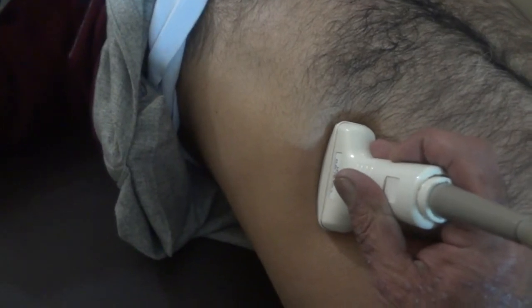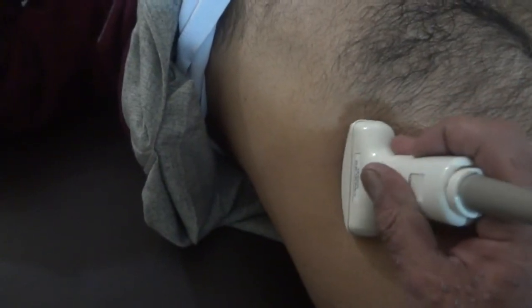Now, for the comparison of the right kidney with the liver, in the lumbar region, almost in the intercostal space, maneuvering in this direction, or placing the probe down in the subcostal region, asking the patient to take a deep breath and hold it, and then moving the probe according to the requirement, so that you can see the liver and right kidney together for the comparison of the parenchyma of both organs.